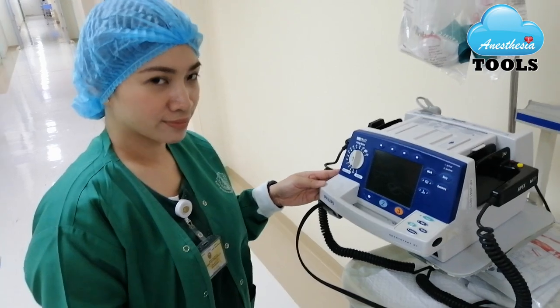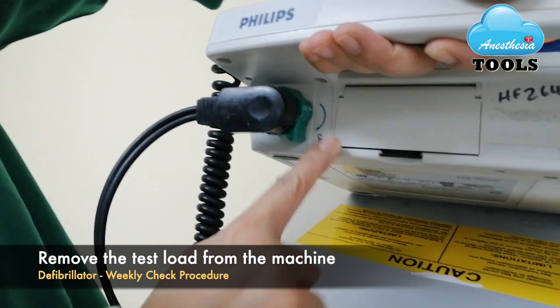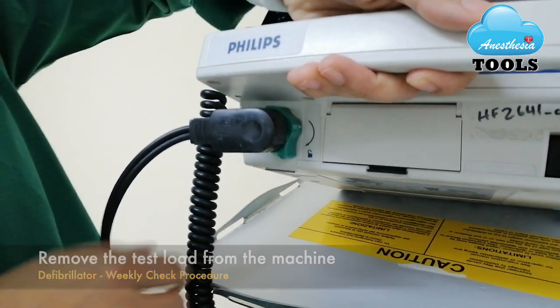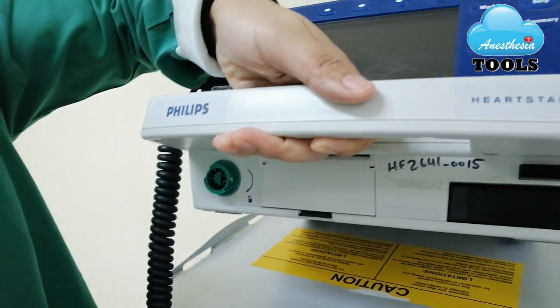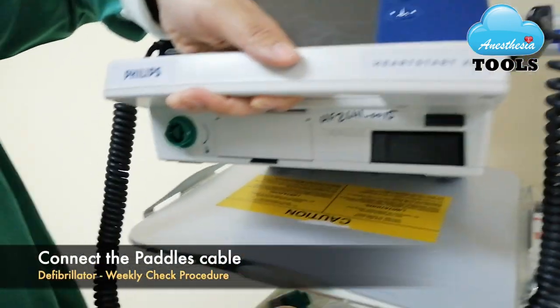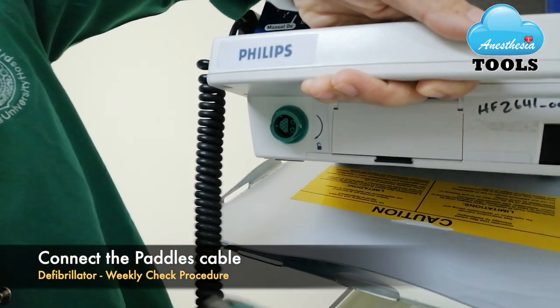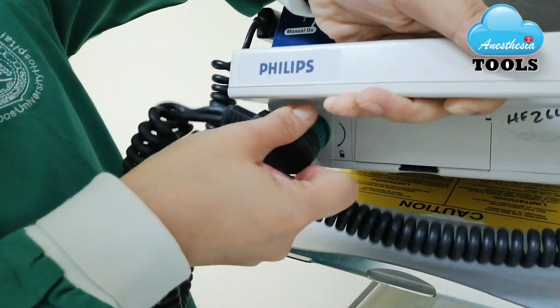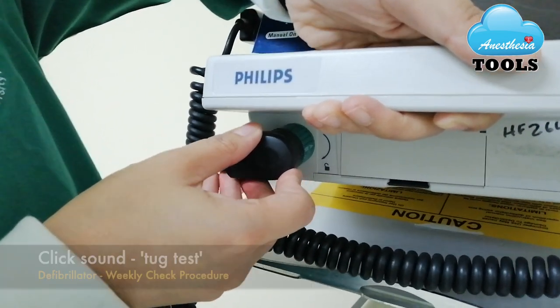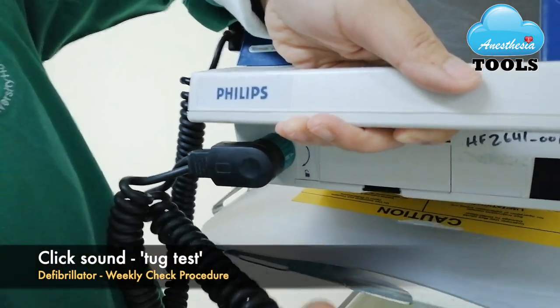Thank you once again, Dianne. What we have to do is remove the test load first from the machine. There is the unlock option — she will be unlocking it very gently. The test load has been removed and she will be connecting the paddles, as shown in the picture. We will hear the click sound and she will do a small tug test to make sure it's tight.